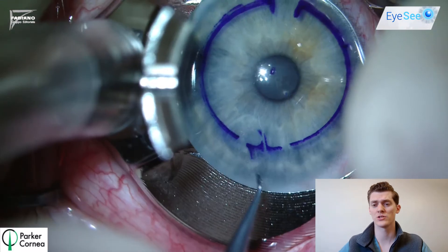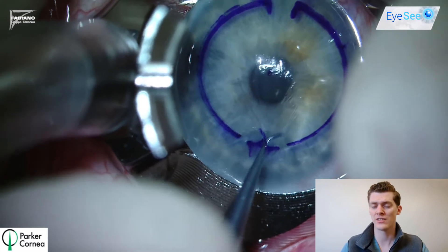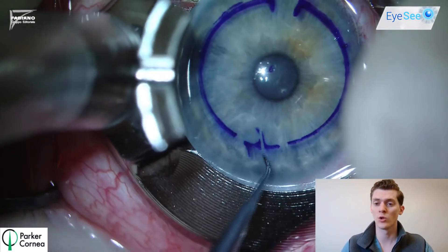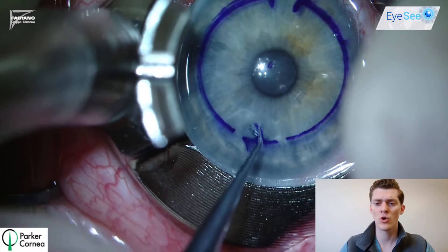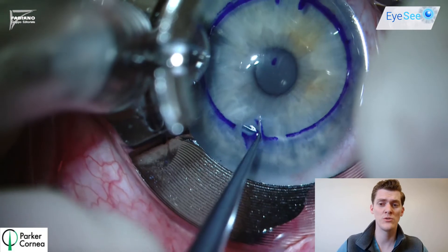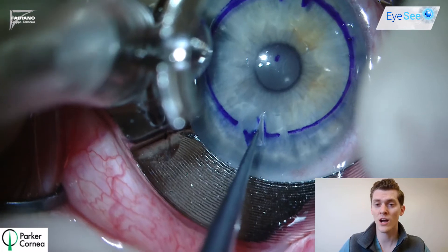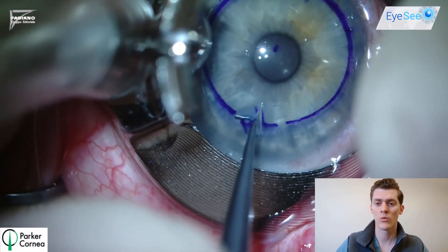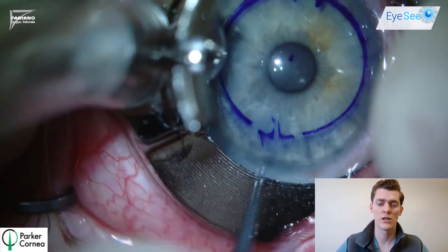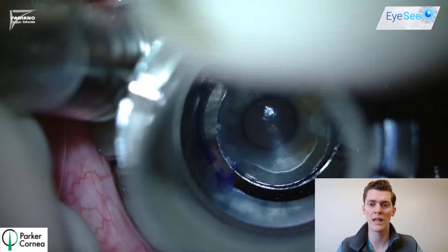To answer that question we must determine if it's safe to proceed. So we reinsert the Sinskey hook back into the incision and dissect a little bit of the stroma. We notice that the globe remains intact and no aqueous continues to leak from the wound. We therefore continue the operation and make the stromal pouch slightly more anterior, meaning not quite at the base. We're able to successfully do this and not interfere with the perforation, so we can then continue to dissect the semicircular channel using the corkscrew blade.